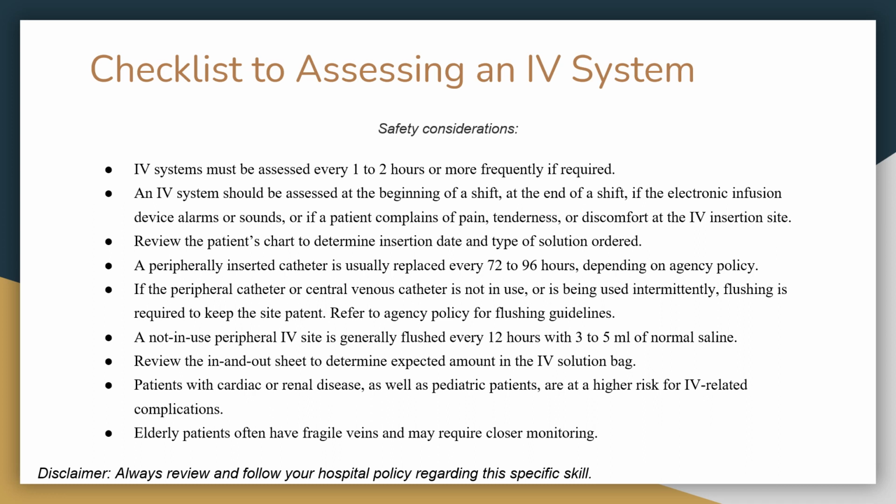All IV systems must be assessed every 1 to 2 hours or more frequently if required. An IV system should be assessed at the beginning of a shift and at the end of the shift, if the electronic infusion device alarms or sounds, or if a patient complains of pain, tenderness, or discomfort at the IV insertion site. Review the patient's chart to determine insertion date and type of solution ordered.